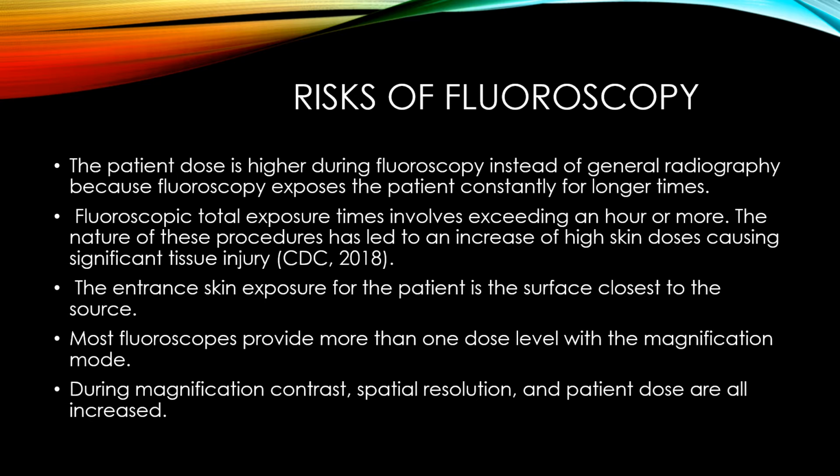There are multiple kinds of risk when it comes to fluoroscopy. The patient dose is higher during fluoroscopy instead of general radiography because fluoroscopy exposes the patient constantly for longer times. Fluoroscopic total exposure times involves exceeding an hour or more. The nature of these procedures has led to an increase of high skin doses causing significant tissue injury. The entrance skin exposure for the patient is the surface closest to the source. Most fluoroscopes provide more than one dose level with the magnification mode. During magnification, contrast, spatial resolution and patient dose are all increased.